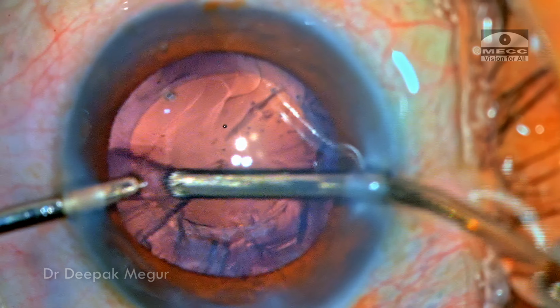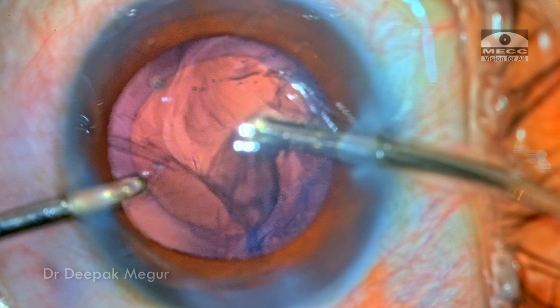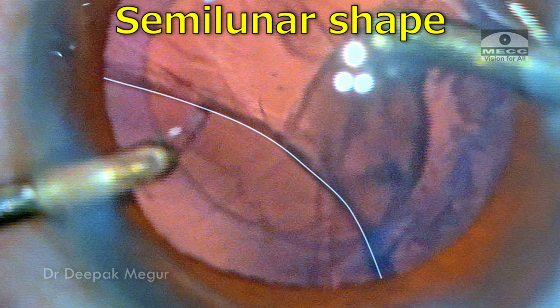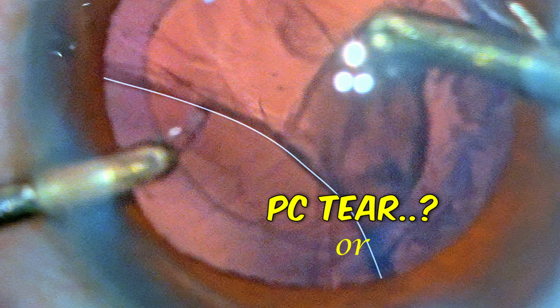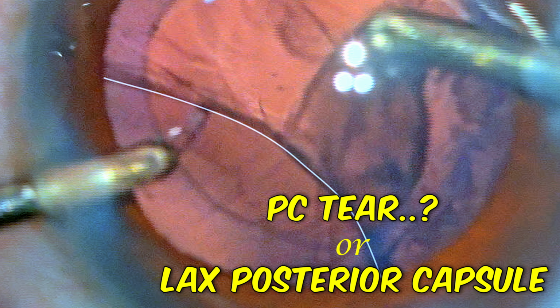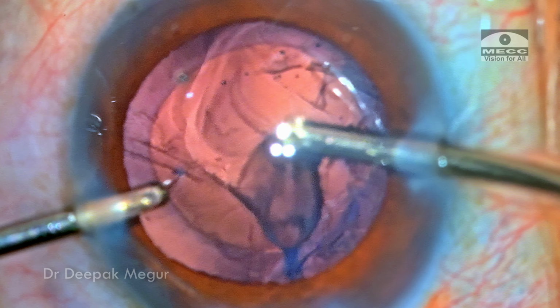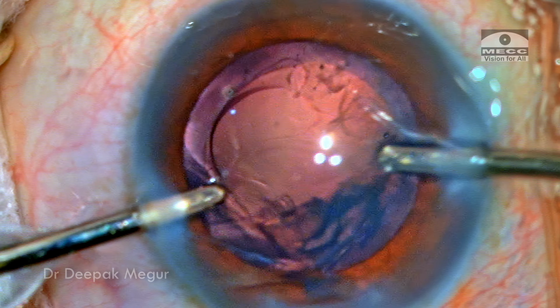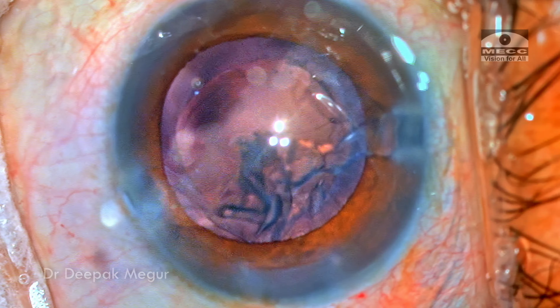I reach this area where suddenly I can see that the posterior capsule is being dragged front. At this moment, looking at the semilunar shape, my first reaction was, is it a PC tear or is it a lax posterior capsule because of the laxity of the zonules? I wasn't sure. So I paused there for a moment, pushed the reflux button, left the cortex there, let it relax itself, and come out. Now I'm trying to analyze what this could be.